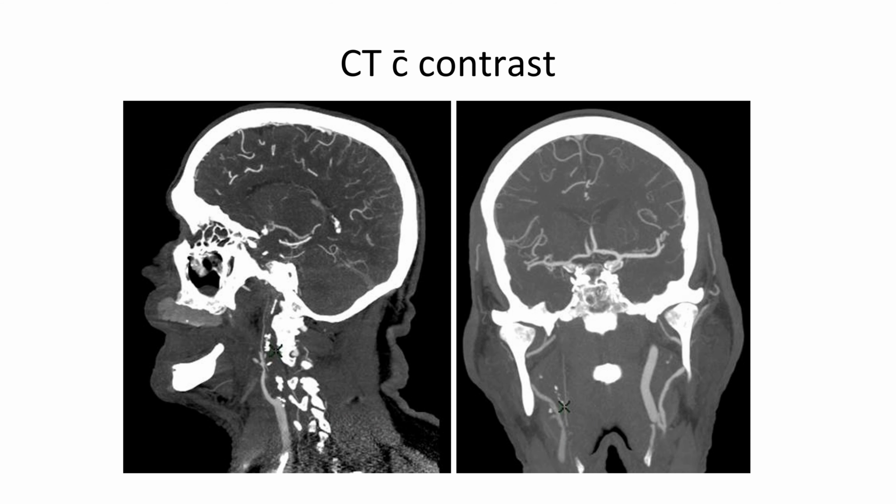Next, we have a patient with atherosclerotic disease. This is carotid stenosis. You can see here that there's actually an X over the pathology on the image on the right that is facing towards us. So you can see that the right internal carotid artery has essentially disappeared.